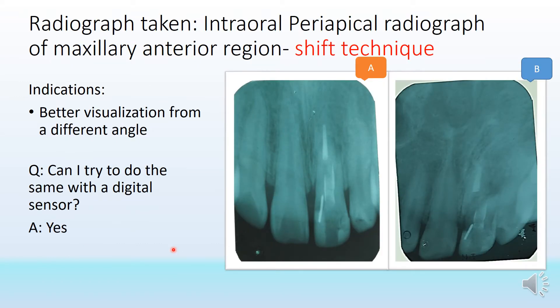Today the radiograph shown is an intraoral periapical radiograph of the maxillary anterior region. We have two radiographs here — A and B. Both are showing the same region, but radiograph B is different from radiograph A because it was taken with a tube shift.